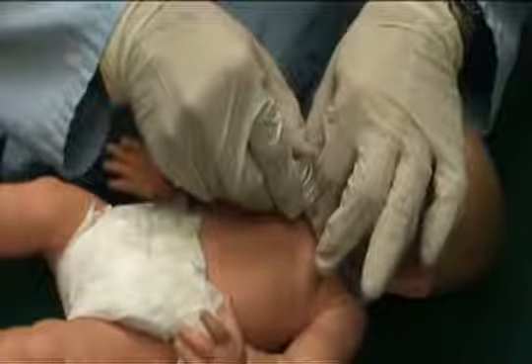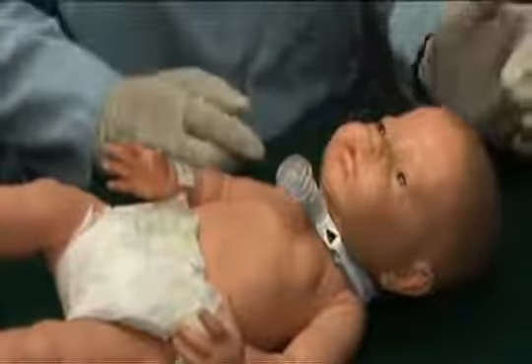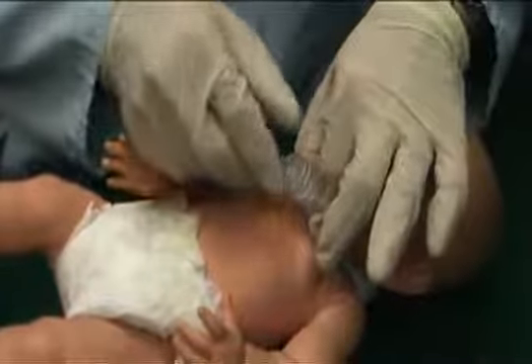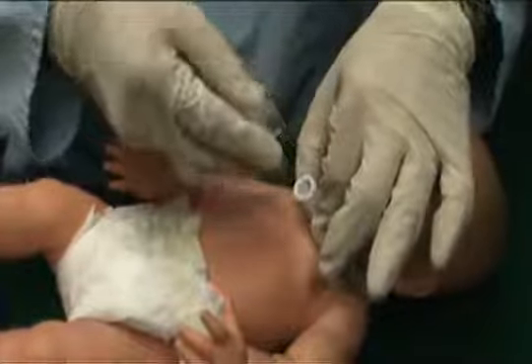turn. To remove the valve, you must again ensure that you're wearing non-sterile gloves. While firmly holding the base of the connector with one hand, use your other hand to gently rotate the accessory while pulling up, which loosens the seal.